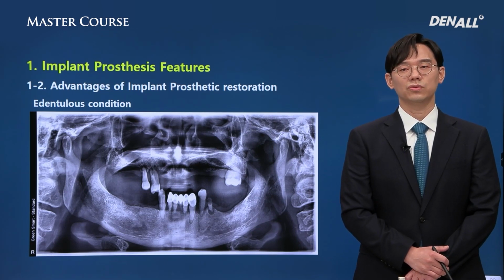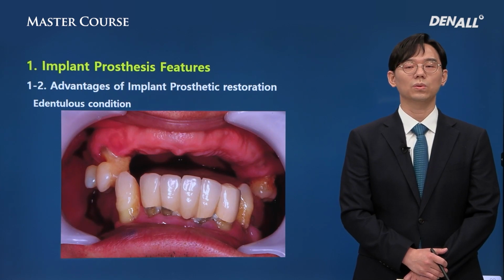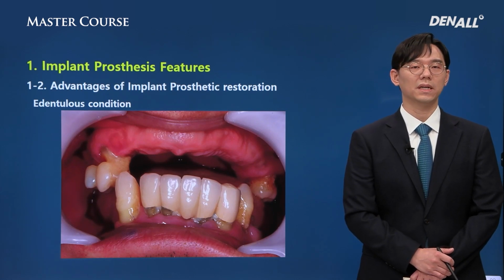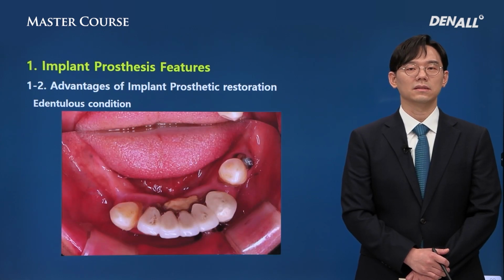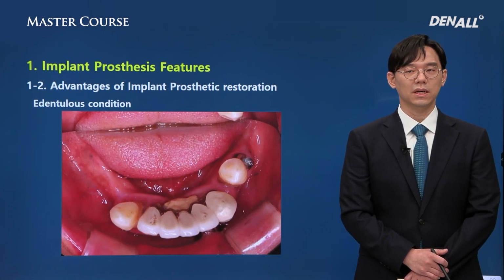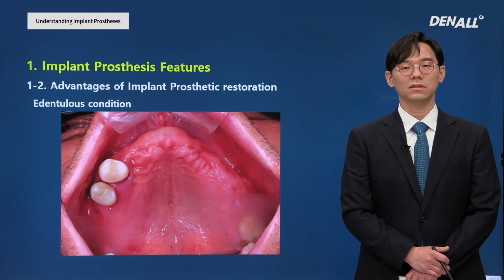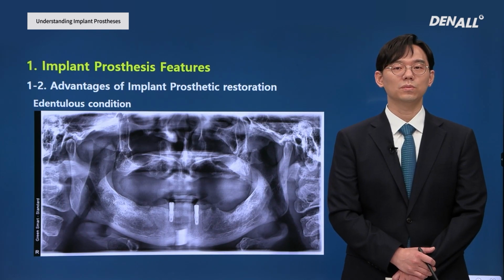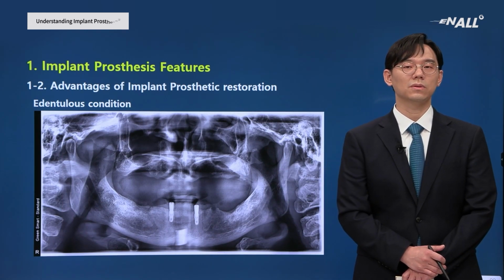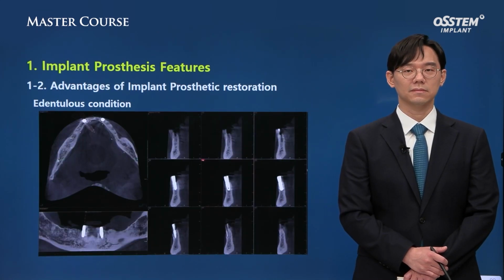This patient complained of anterior teeth mobility, and because mobility was very severe, all residual teeth needed to be extracted. As for the lower, 2 implants were to be placed along with locators for overdenture treatment. As for upper, conventional denture treatment was going to be provided. All residual teeth were extracted and implants were placed in early placement way in the lower.